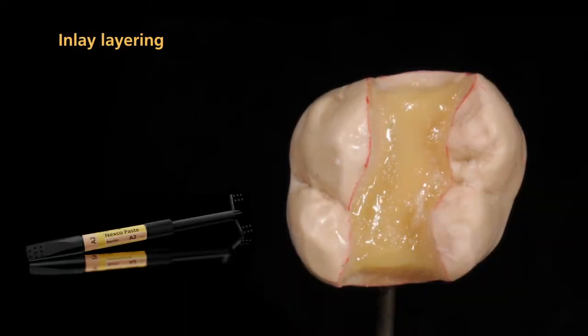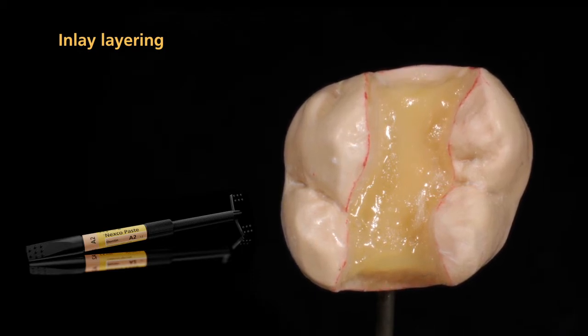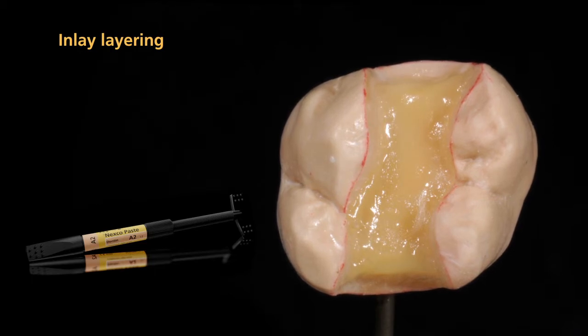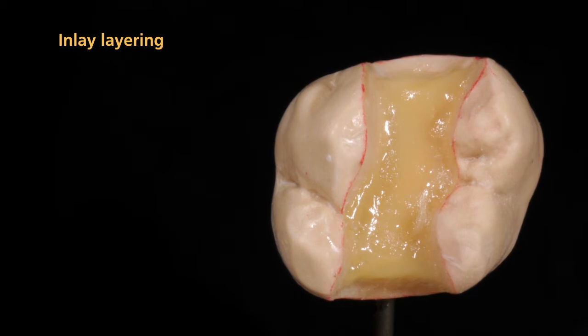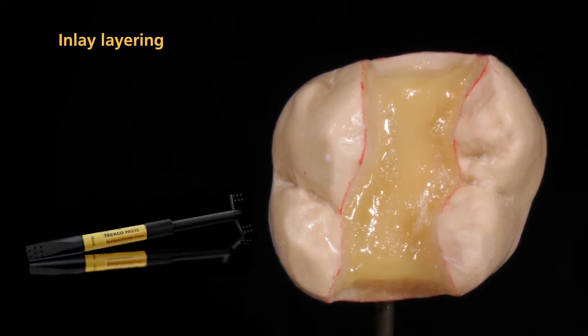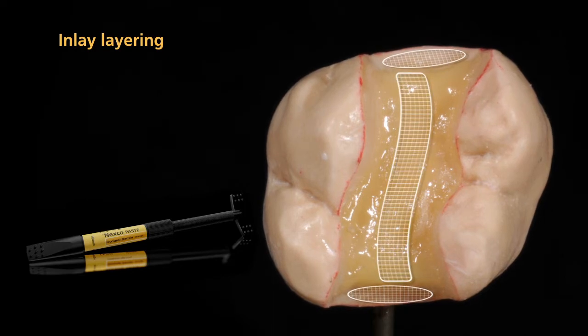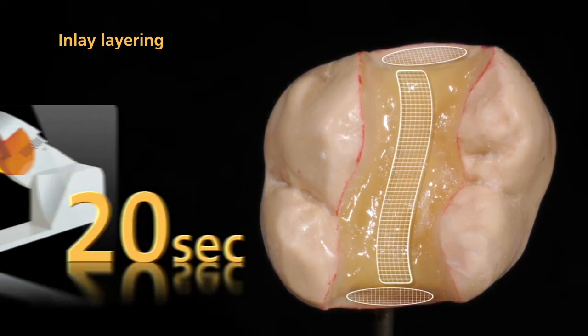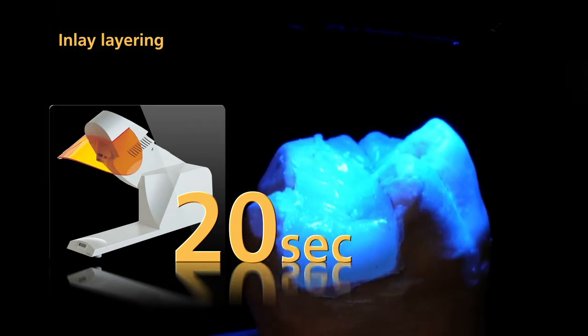The actual layering procedure now begins. Press the first layer of Nexco paste firmly onto the liner surface to ensure an effective bond between the liner and the composite. To increase the shade effect in the interdental area and cavity, you may want to use occlusal dentin. Then, pre-cure each segment again for 20 seconds using a quick pre-curing light.